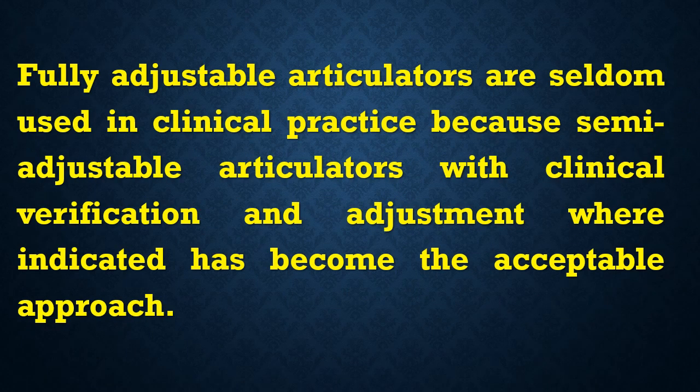Well, the fully adjustable articulators are seldom used in clinical practice because semi-adjustable articulators with a clinical verification adjustment where indicated have become the acceptable approach and the most popular one.